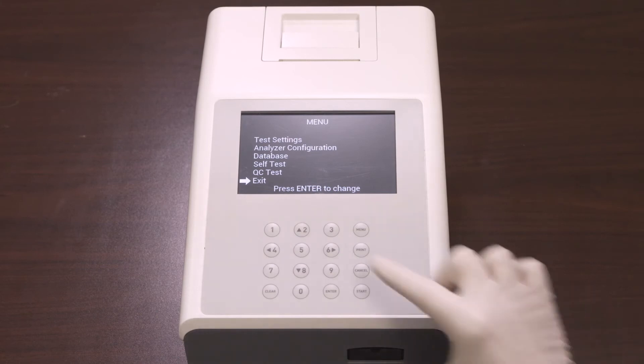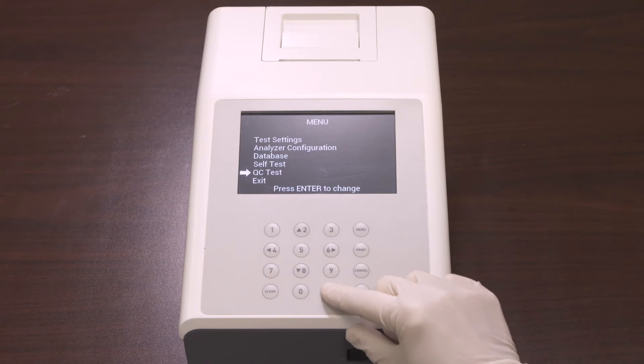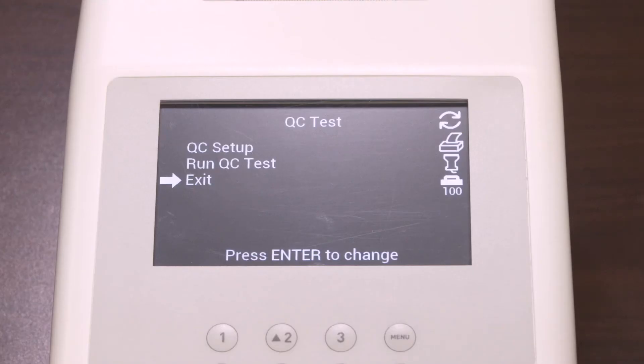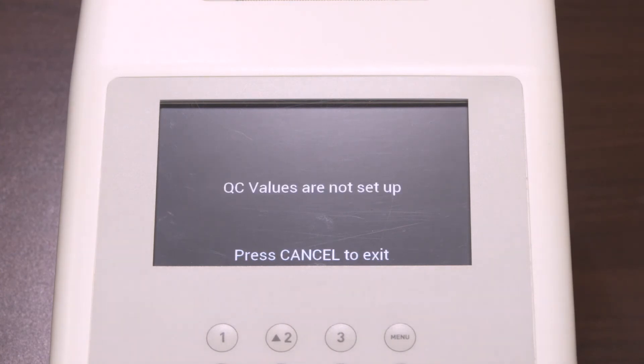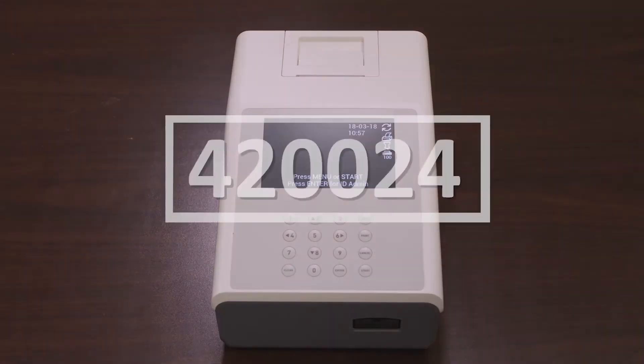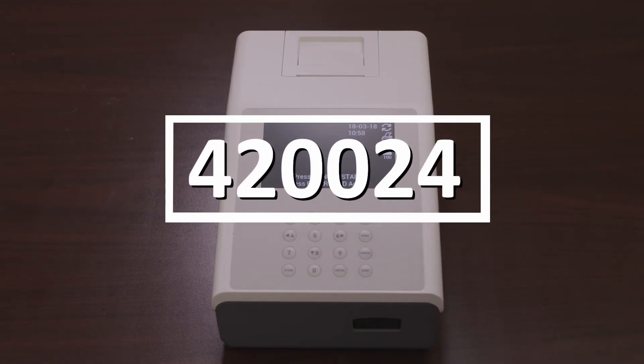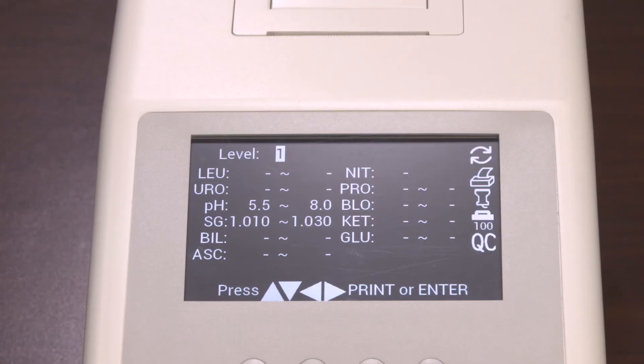The last option in the main menu screen is the QC Test. Select QC Test on the menu and press Enter to run a QC Test. Select Run QC Test and press Enter to perform a QC Test before the next scheduled test time. When a QC Test is run for the first time, the analyzer will show a screen if the QC values have not been set up. To set the QC values from the initial screen, enter the passcode 420024 to show the QC value setup screen.